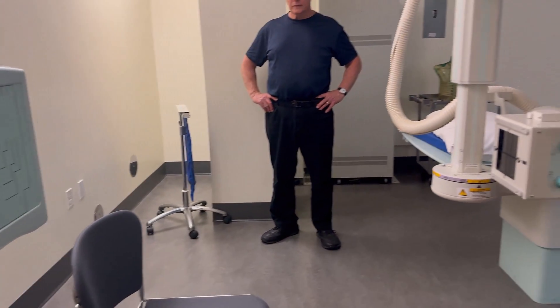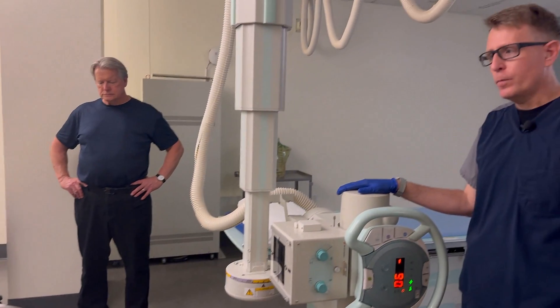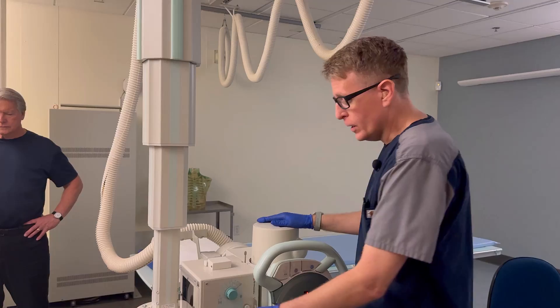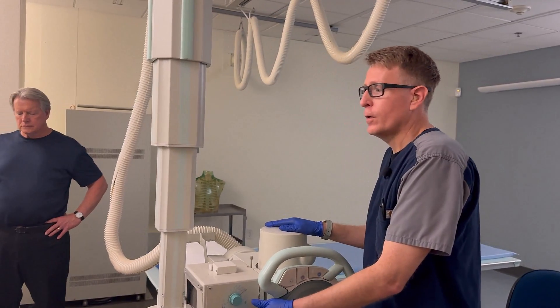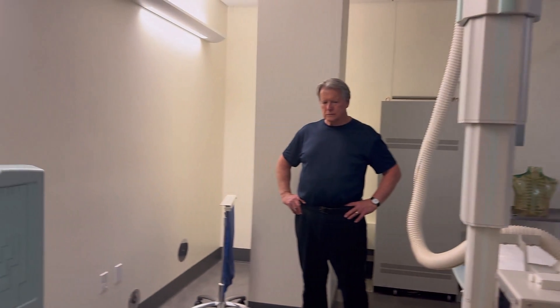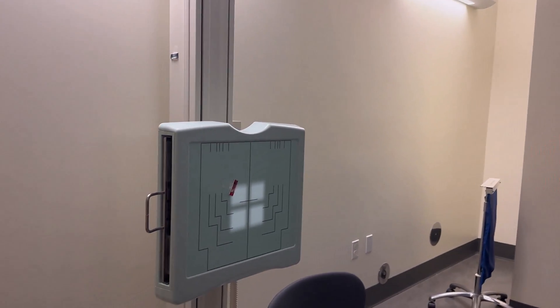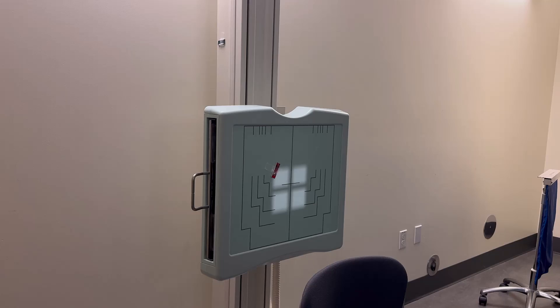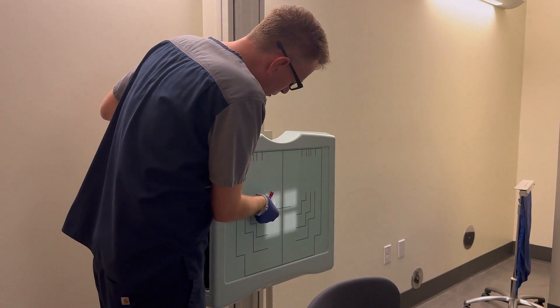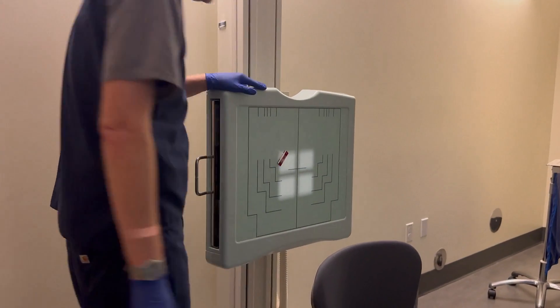I'm going to use a 72-inch SID as before, and I can keep my same 5x5 collimation that I used for my other projections. And if you are doing this view right after the lateral, your marker should already be in the proper position. In this case, if I'm doing an SMV, I can put my right marker in the corner here.